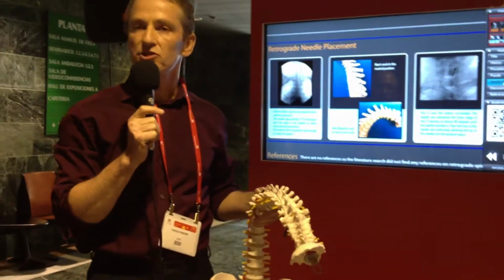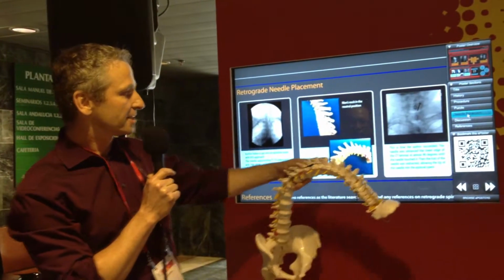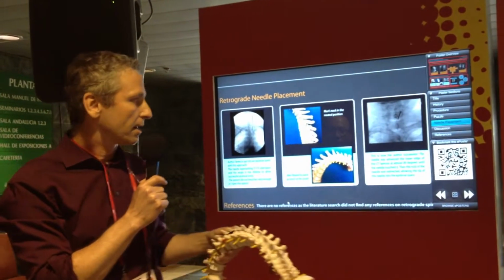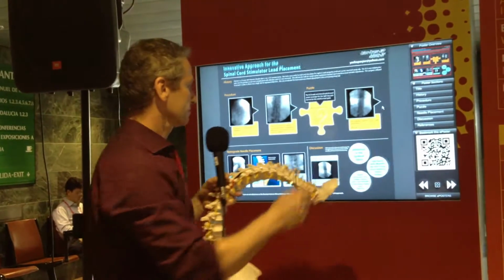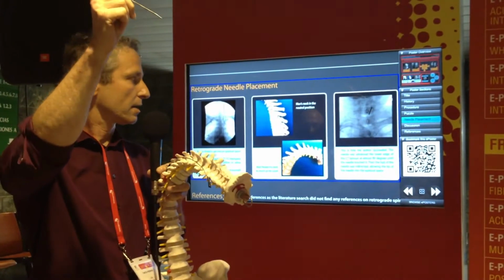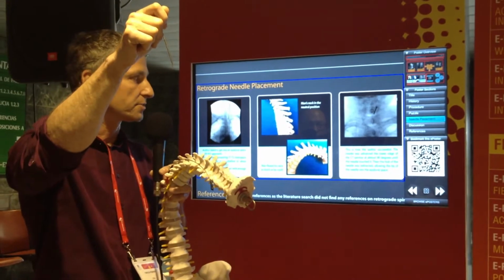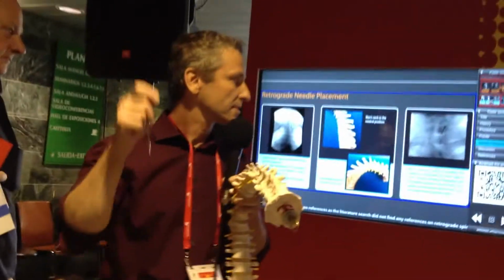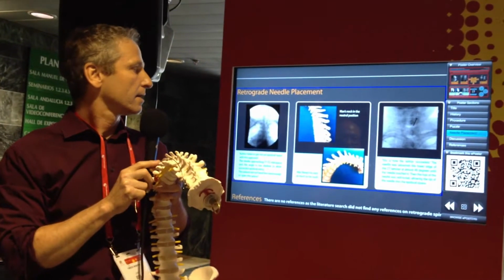A roll was placed under the patient's shoulders to help bend the neck, thus facilitating needle placement. You can see the difference between a bent neck and an unbent neck. The spaces here are bigger. I placed my needle at the lower edge of the C7 lamina and redirected the needle cephalad. That allowed the needle tip to slide into the epidural space. The rest was easy. I slid the epidural spinal cord stimulator lead down to the T8 vertebra.